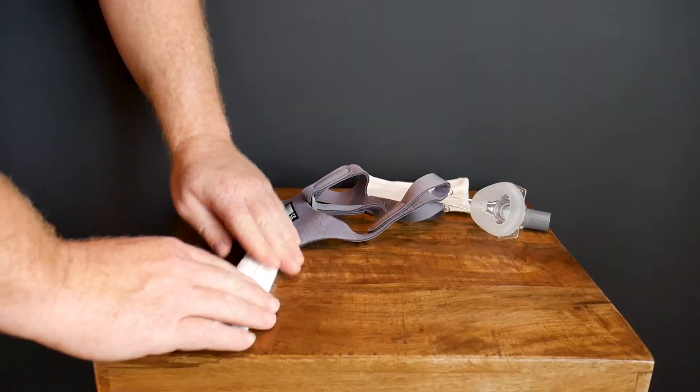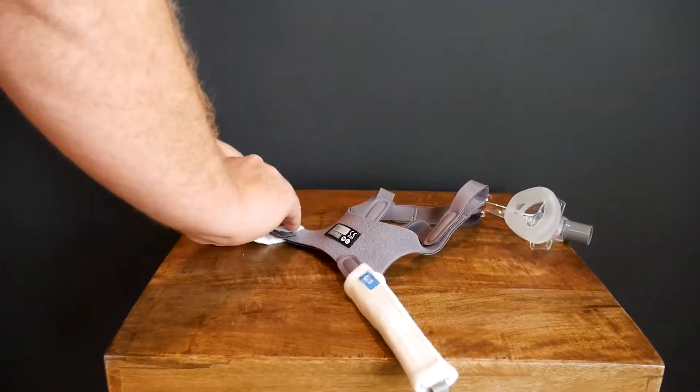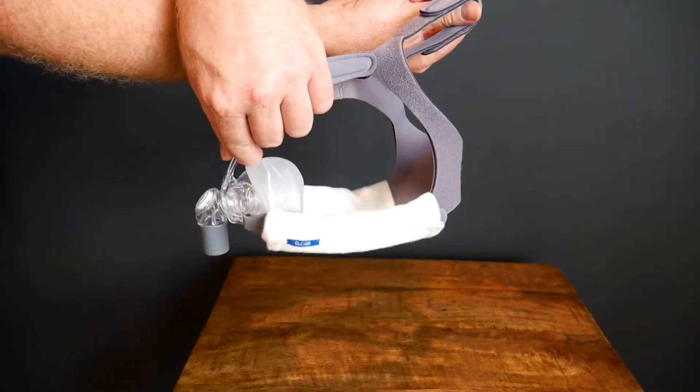Then, with the Velcro fasteners, secure the headgear covers around your face or forehead straps. Be sure the Cloud Tag appears right-side up when wearing.